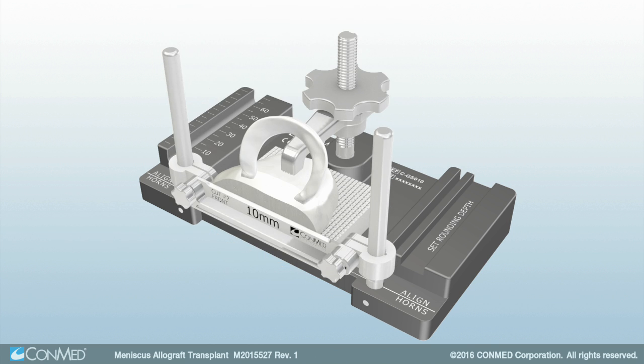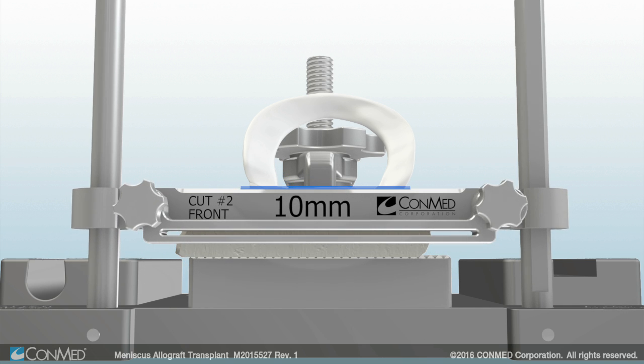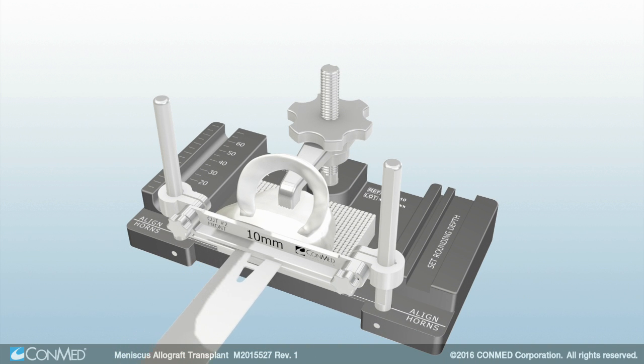Place the horizontal fence over the guideposts so the etching that reads Cut No. 2 faces the front of the graft station. The graft station can be inverted to facilitate alignment and cutting. Align the top of the fence so that it intersects with the midpoint between the posterior aspect of the anterior horn and the anterior aspect of the posterior horn. Then align the horizontal fence so it is parallel with the base of the graft. Perform the second cut to a depth of 15 to 20 mm and leave the fence in place once complete.